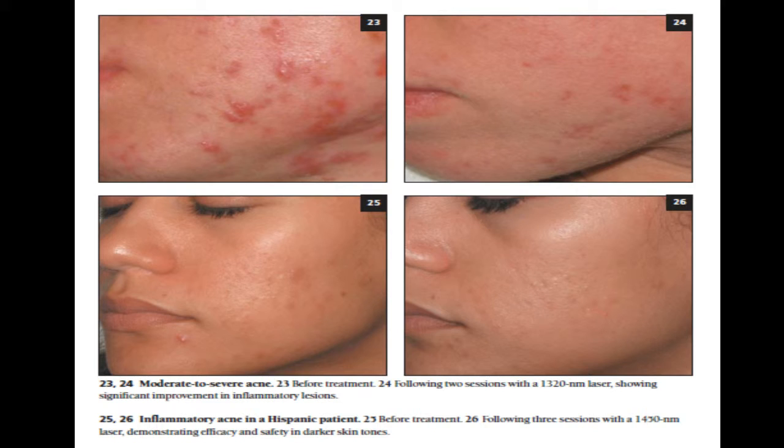The laser can be used in normal, single pulse mode, or pulse train mode with up to 3 pulses/second. Typical fluences range from 8 to 10 J/cm² per pulse and a cumulative fluence of up to 60 J/cm² in pulse train mode to prevent epidermal damage.